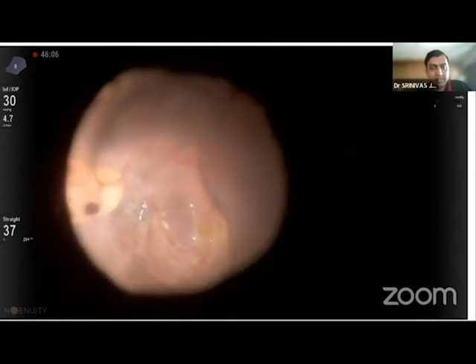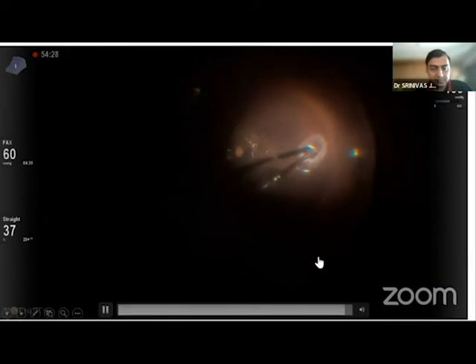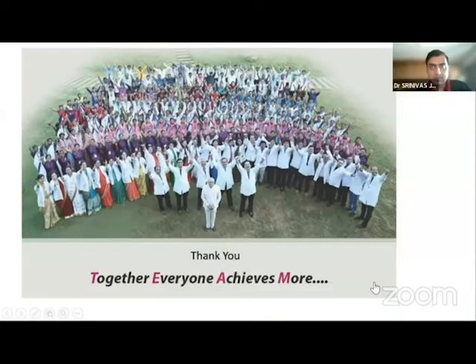Unfortunately, the graft size was pretty much in the optimal size. And this is just 1 week. So I just took an OCT photograph, but I forgot to put it here. It shows a good graft integration in this case as well.